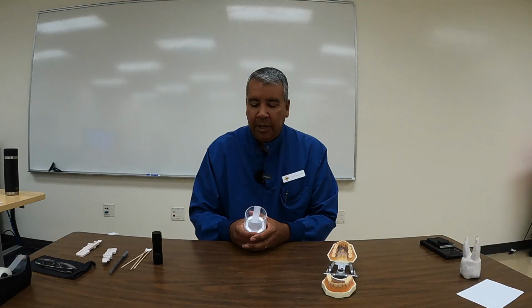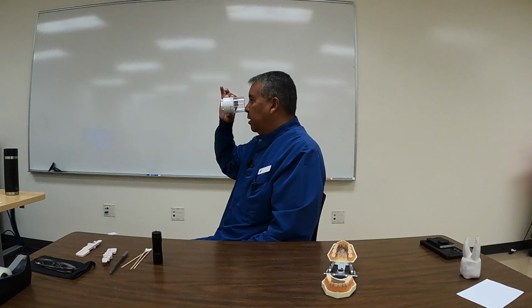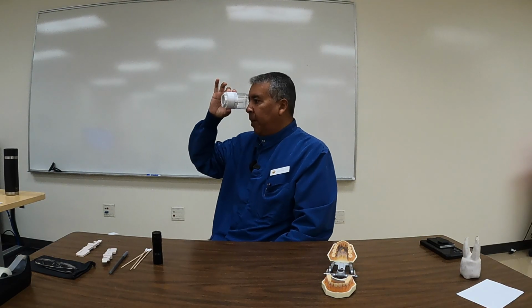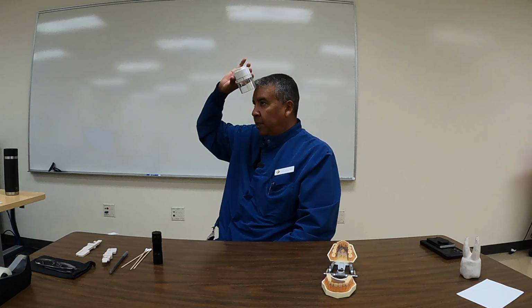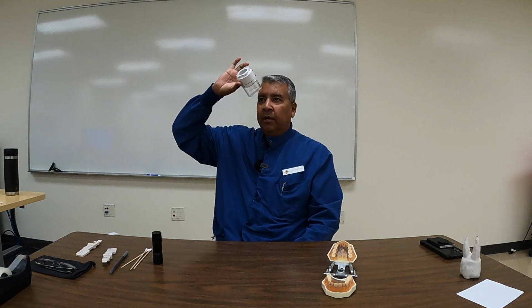You know how they'll get the horizontal angle. But don't make it any harder than you have to, make it easy on yourselves. I don't care what it looks like, because it's going to look different on every single patient. As long as you know where the bisector is, you have to maintain that. Some of your patients, this will be like this, because we're doing a particular technique. Other patients, it'll be like this. Other patients, it'll be like this. It really depends on the angle of their mouth.